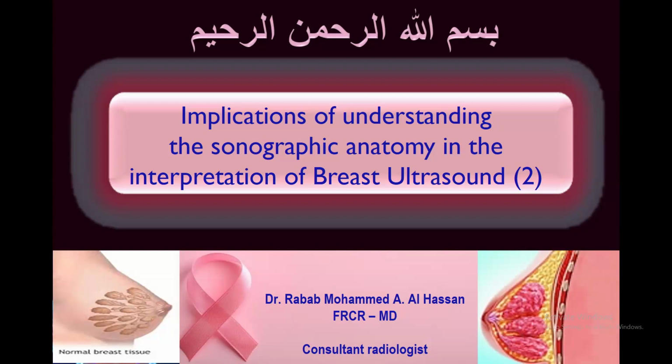As we said before, besides all the advantages of breast ultrasound, it is crucial for us because of our limited mammographic facilities. So we have to study and study and study.